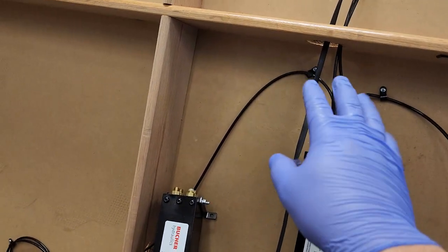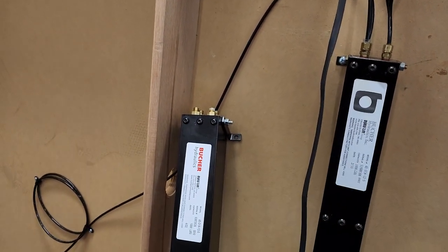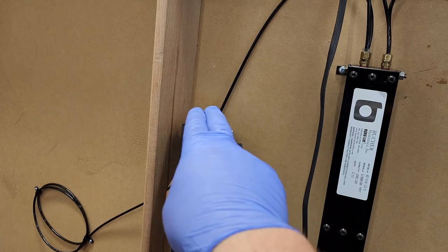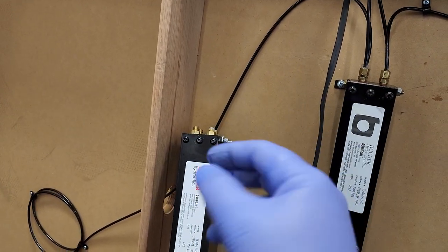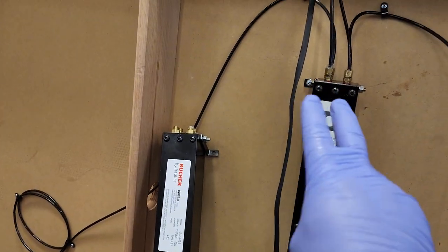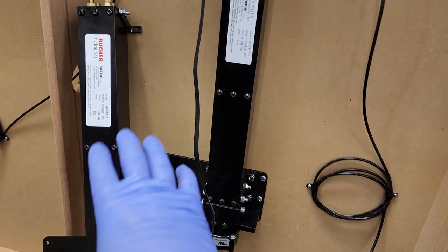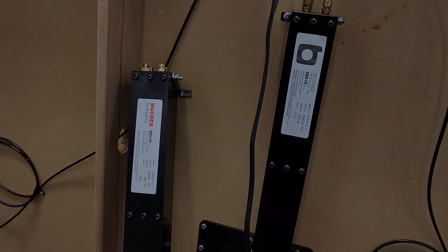So we already proved that the legs are fine. It's actually one of the chambers in here. Probably a little bypass check valve or something is bad. So what we're going to do is move these lines over to this one while it's still attached. That way we have minimal oil loss and minimal air getting into the system, because this is hydraulic. So we're going to move them over one by one really quickly. That way we're not leaking all over the place. And then we'll unbolt it, bolt this one up. Bob's your uncle. We're good to go.